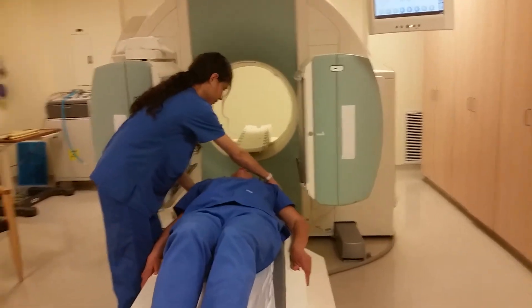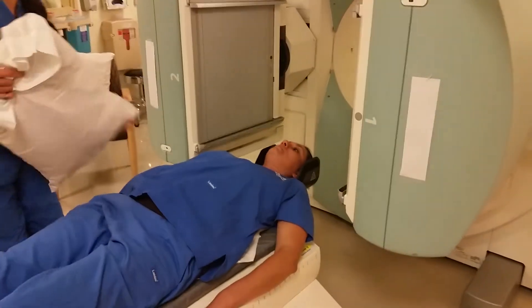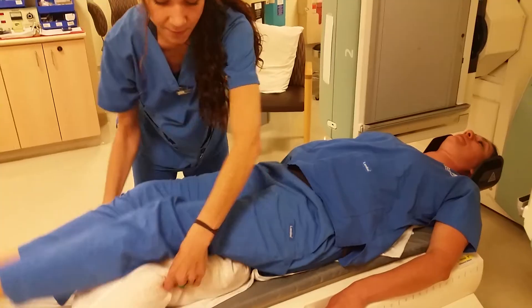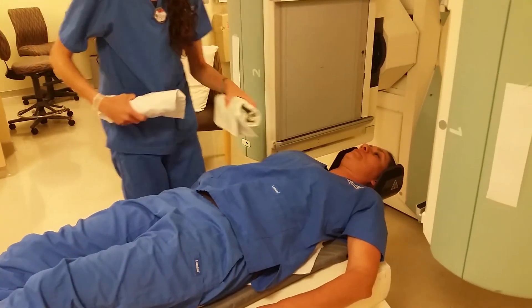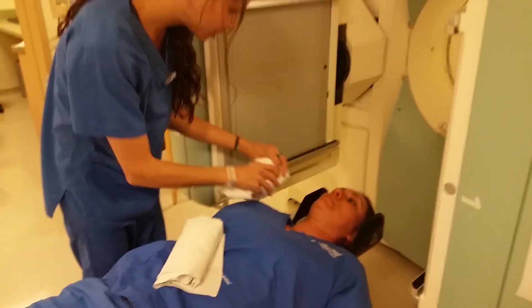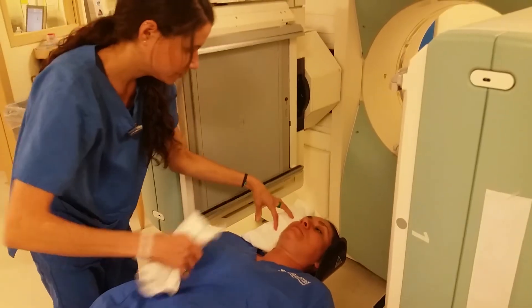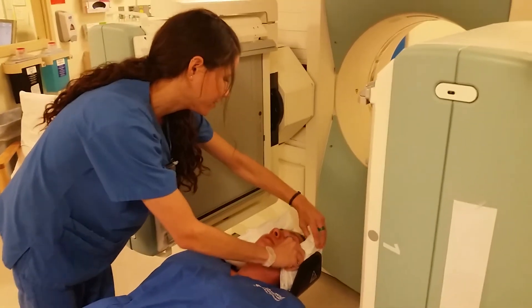That looks good. I have this pillow right here that I'm going to put under your knees — it'll just take a little bit of pressure off your back. And then since I want your head nice and straight and not moving at all, I have these little cushions I'm going to tuck right next to your face. I know it's kind of uncomfortable. There you go.